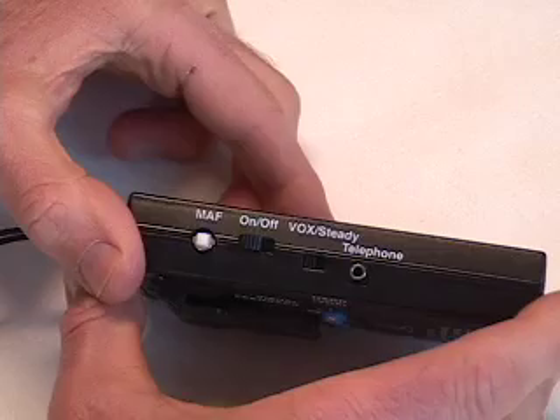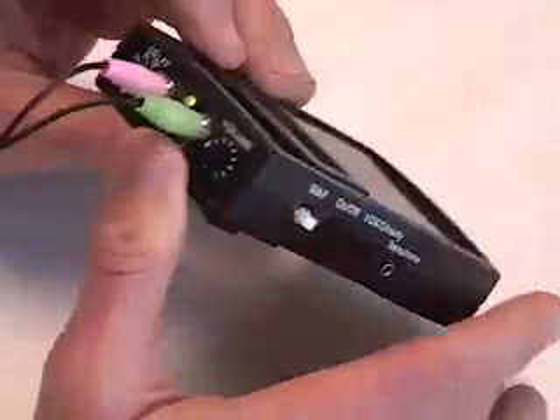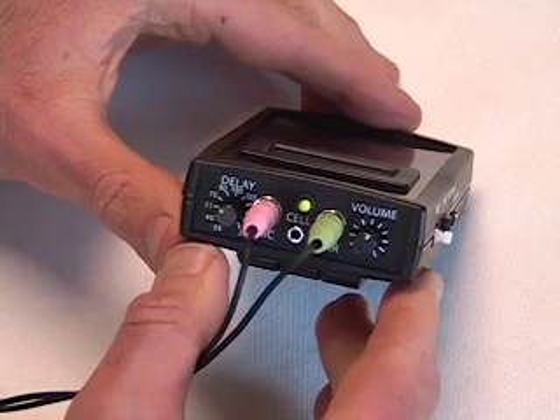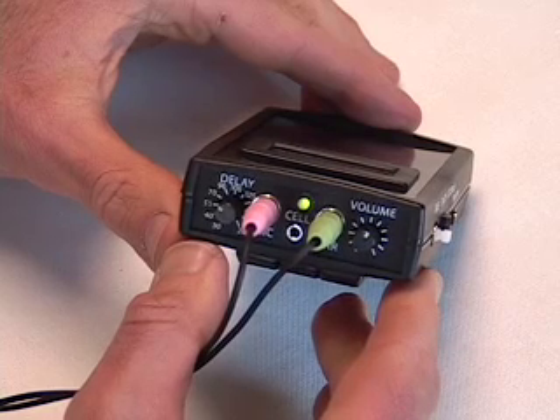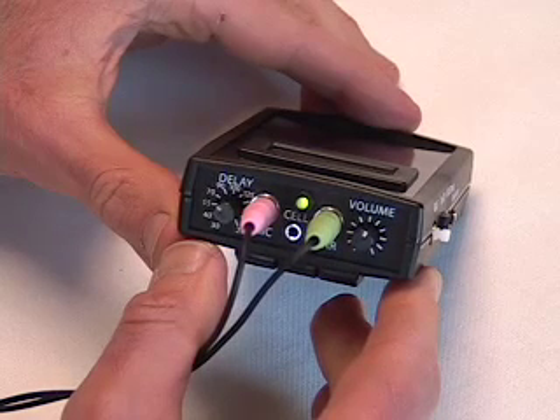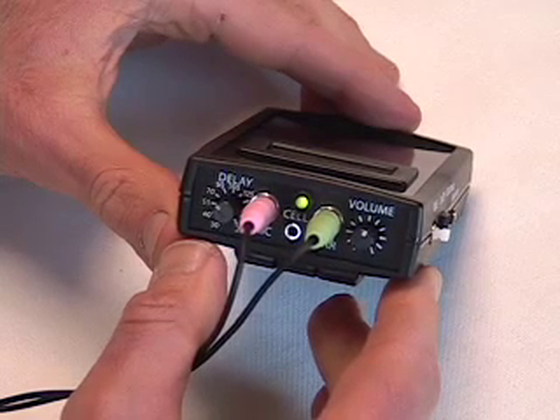This is called negative feedback. If you use this feature and you're able to keep the light green and the sound off, you're ready to take the headphones off and continue to talk fluently. In other words, this feature trains carryover fluency when you're not using the device.